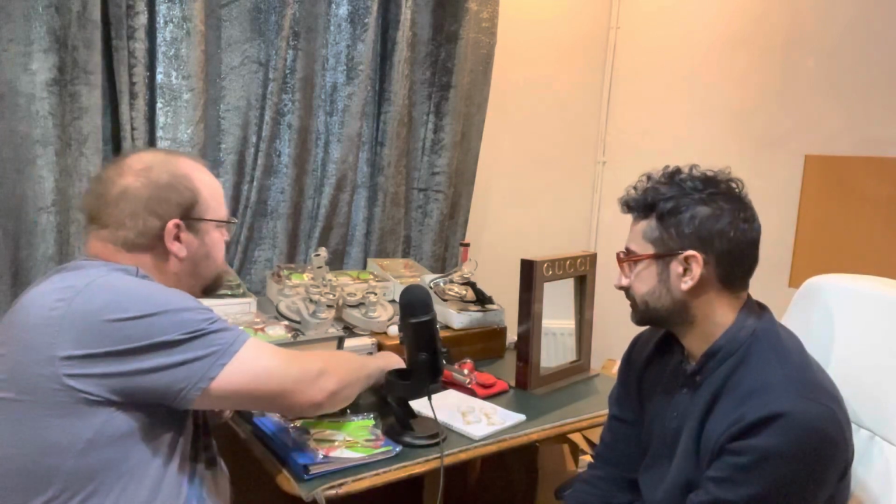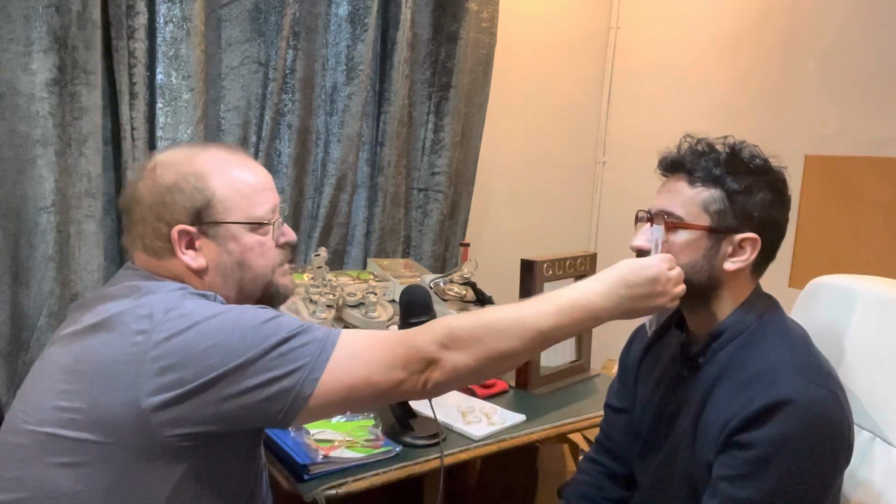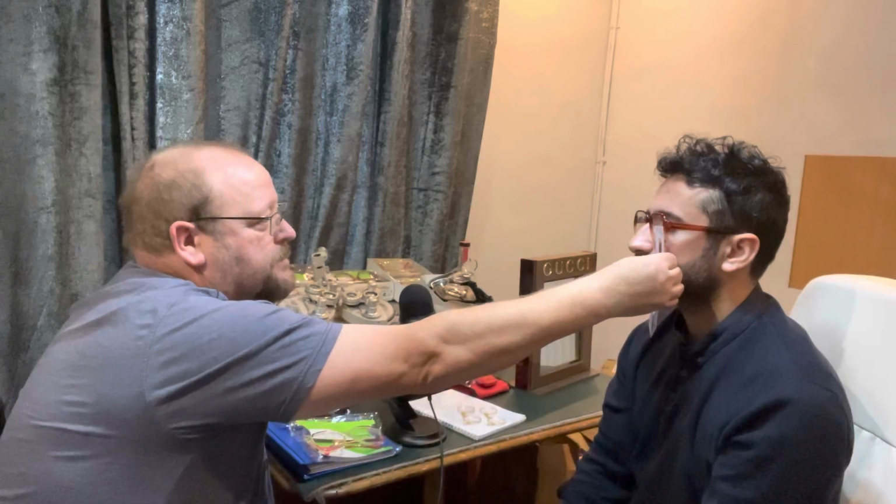I need to record that. I'll record it in a moment. And then I'm just measuring, or if you can sit a bit more relaxed, keep your head in its natural position. That's perfect. That's a 20 height for the bifocal. It is bifocal you want, not a varifocal, isn't it? Yeah, bifocal, please. Yeah.